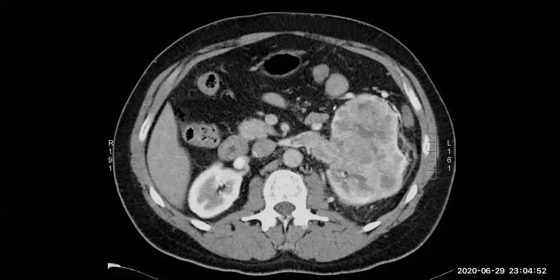Stage four, I think, invading the renal vein. Invading the renal vein, it is stage three. Okay, three, I'm sorry. Staging renal vein, it is stage three. But here, is it outside the kidney or inside the kidney? The fascia is involved, right? Yes, it is involved.